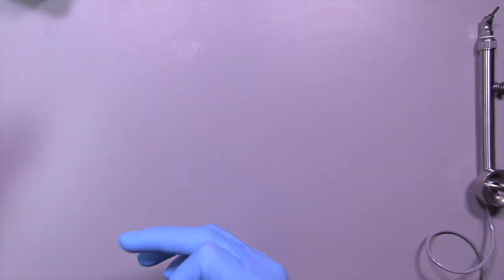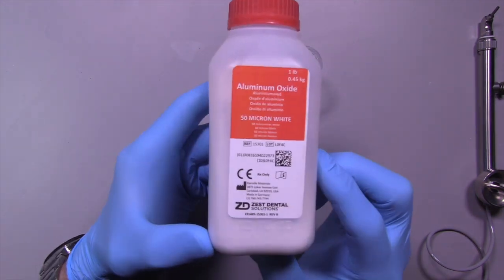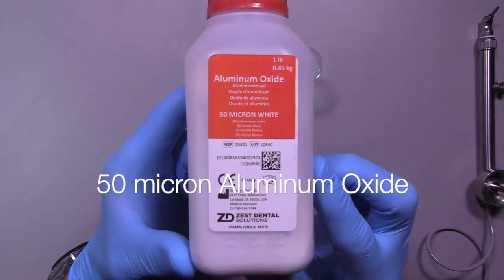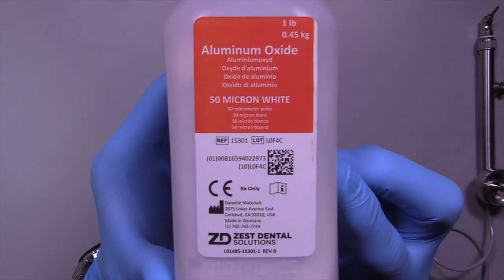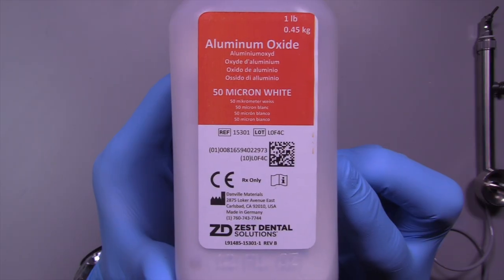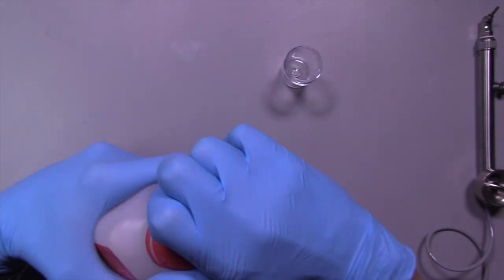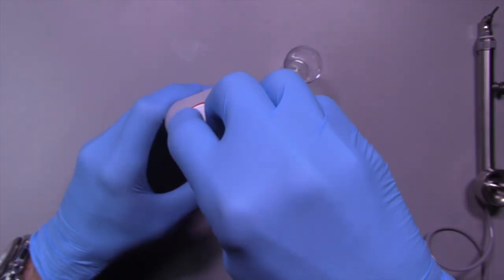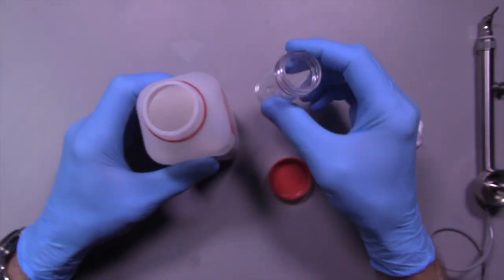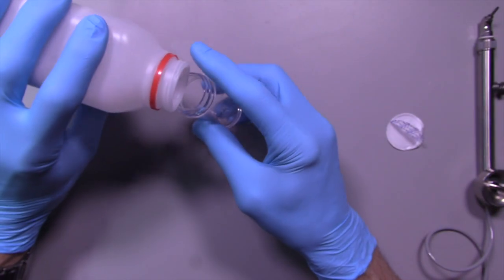You just take this little receptacle and fill it with aluminum oxide. I happen to like using 50 micron aluminum oxide — once again, this is by Zest Dental Solutions. They also have 27 micron and larger sizes, but I think the 50 micron size works quite well. It's relatively inexpensive, so I think this is a system every dental office should have.